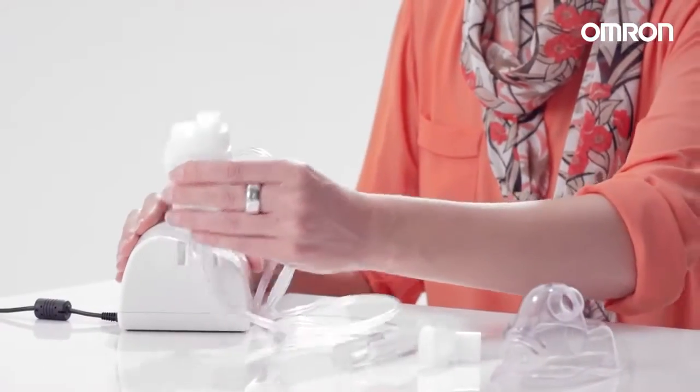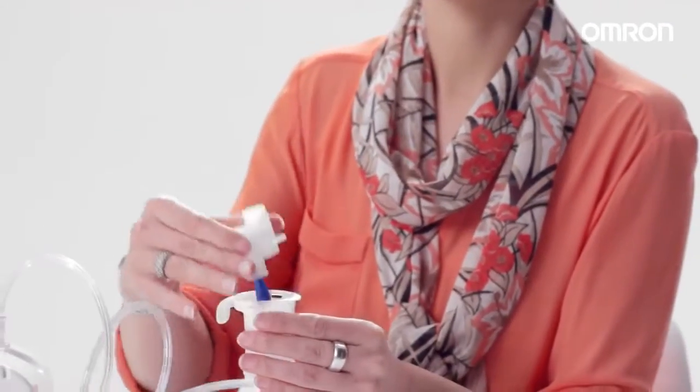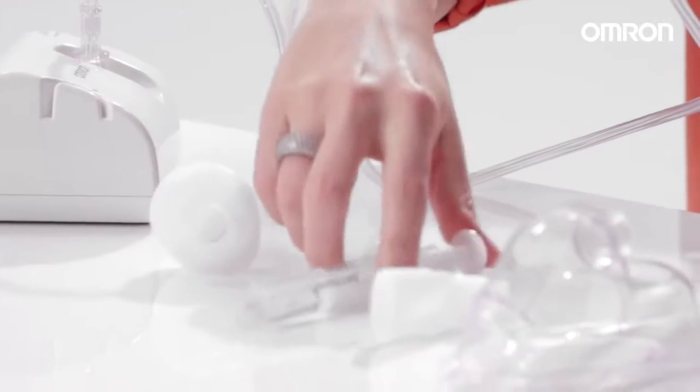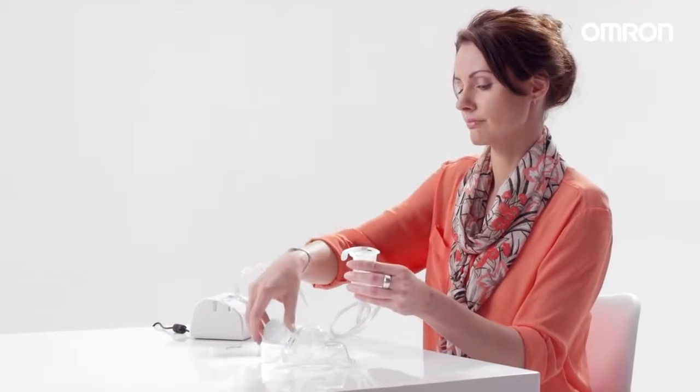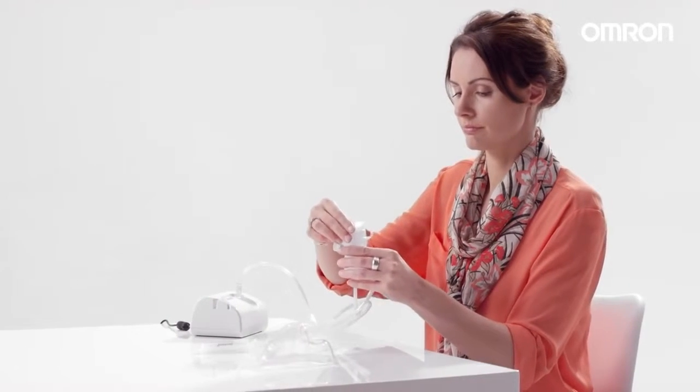Rotate the inhalation top anti-clockwise and lift it out of the medication tank. Pour the correct amount of prescribed medication into the medication tank. Put the inhalation top back and attach the cap.